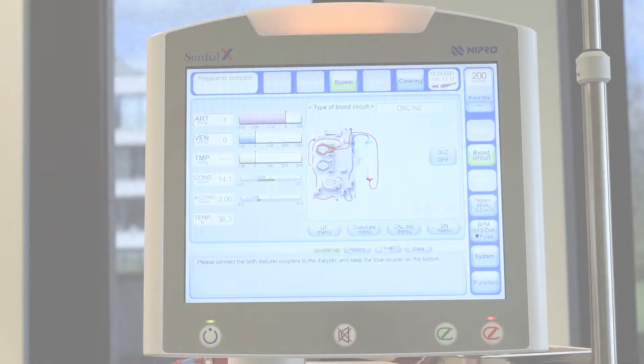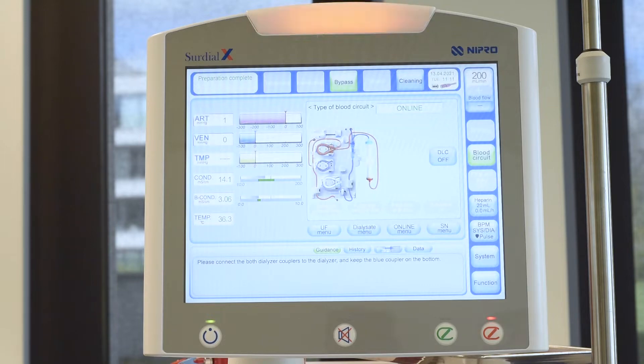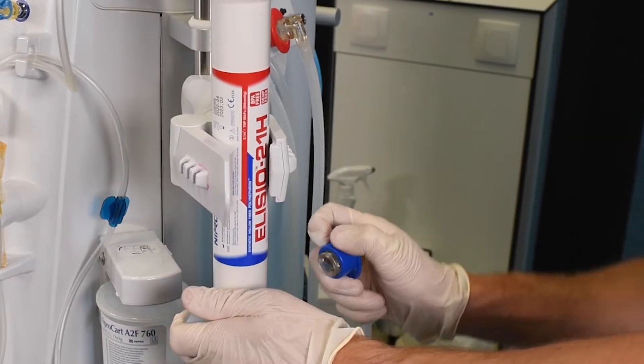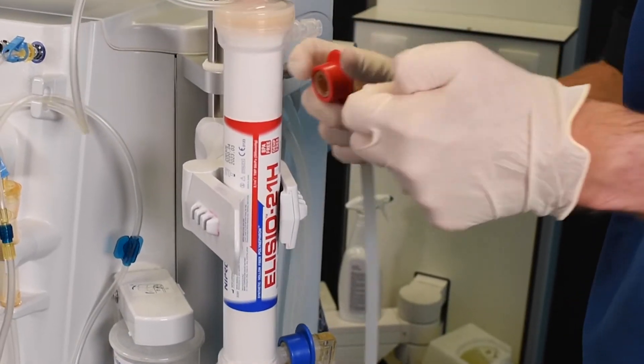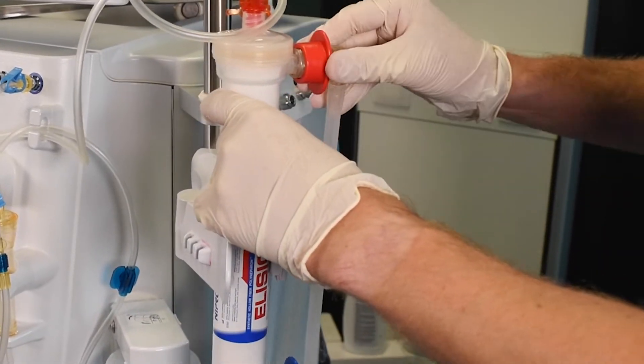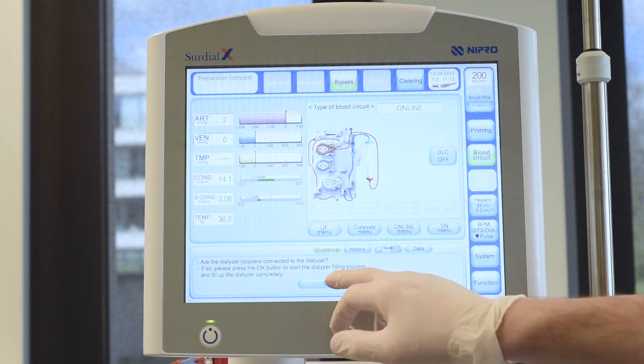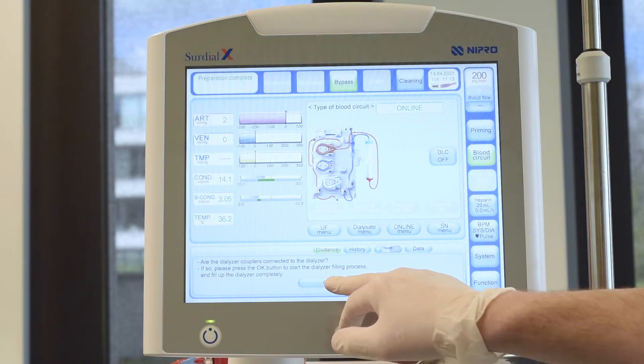To prepare for the priming of the dialysate compartment, turn the dialyzer with the blue side down as prompted by the machine and attach the dialyzer couplers. Once the couplers have been attached, follow the screen prompt and press OK to fill the dialysate compartment.